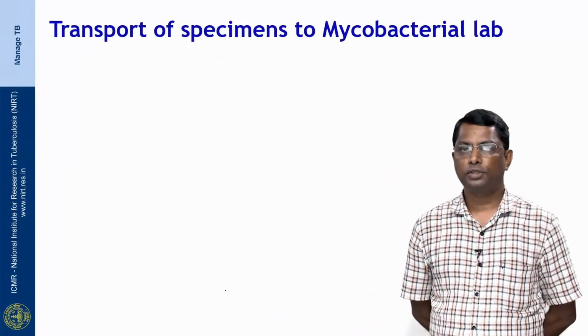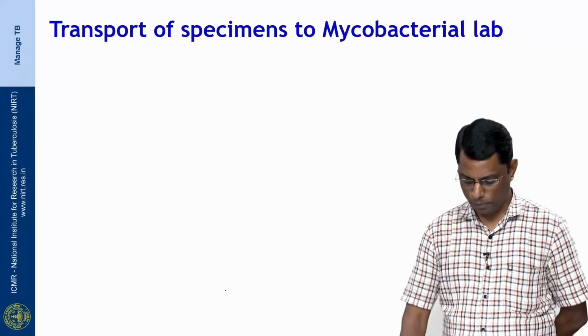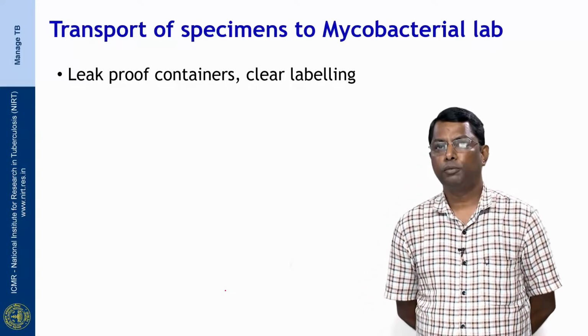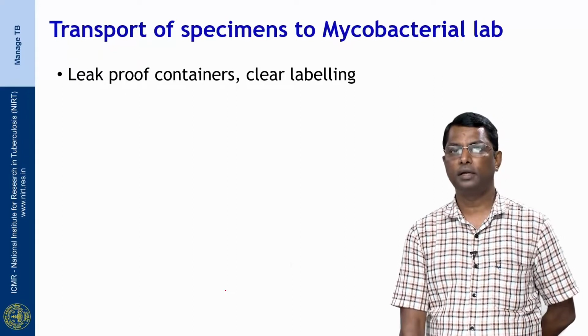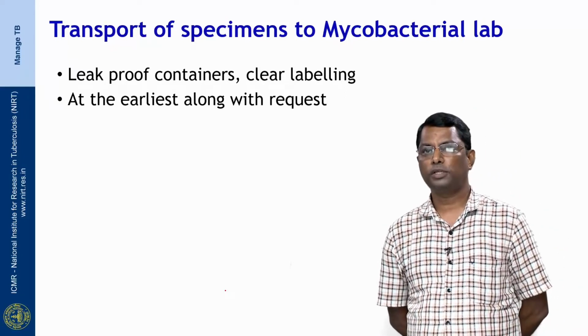The sputum also needs to be transported to the respective laboratory in a proper manner. The sputum should be collected in a leak proof container with clear labeling of the patient's identity, and then it should be transported along with a request form.